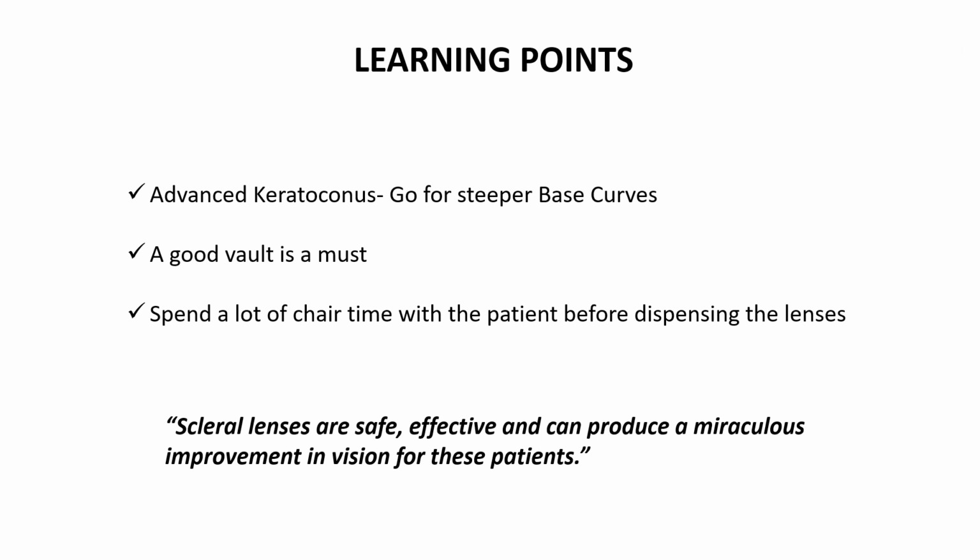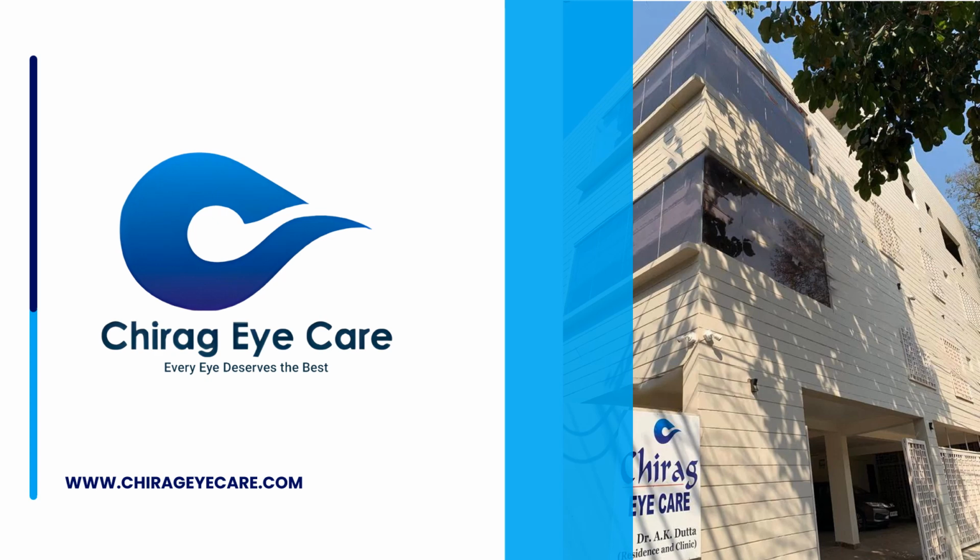Make the patient practice inserting and removing the lenses in front of you. Teach her how to take care of the lenses. There are a lot of resources on YouTube, but when you sit down and explain it to the patient, it will always have a much greater impact. To sum up, scleral lenses are safe, effective, and can produce a miraculous improvement in vision for these patients.